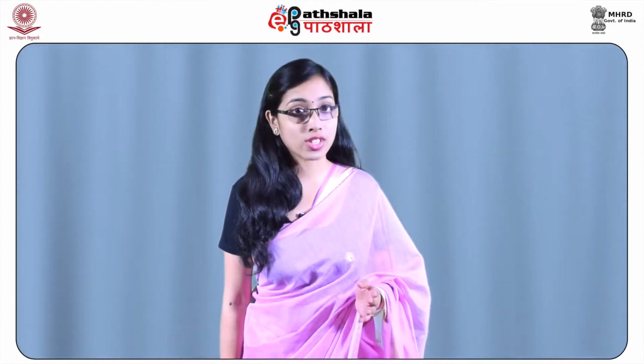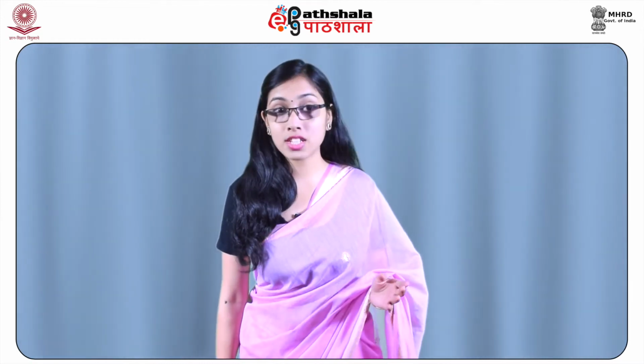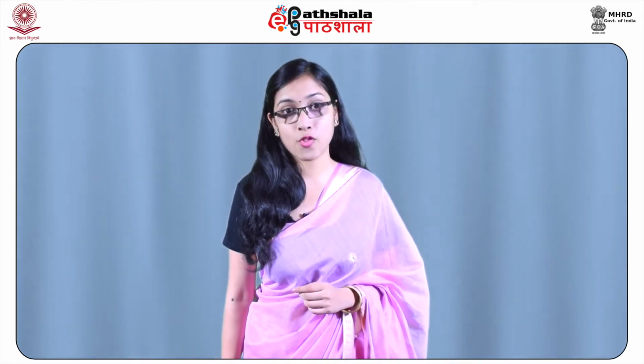Appropriate extraction increases the chance of an effective analysis of drugs and poisons. For example, there is less interference in gas chromatography mass spectrometry, also known as GC-MS, and there is less ion suppression in liquid chromatography mass spectrometry, that is LC-MS. Cleaner extracts also decrease the incidence of downtime of sensitive and cost intensive analytical instruments by increasing the service intervals. In order to develop a successful extraction procedure, some fundamental principles must be considered.